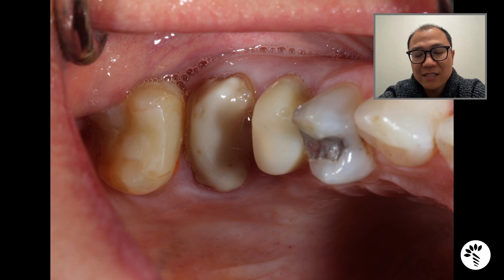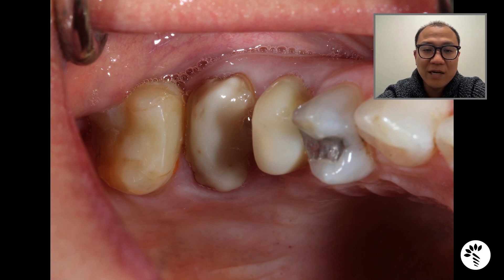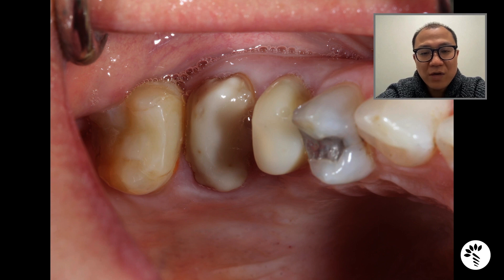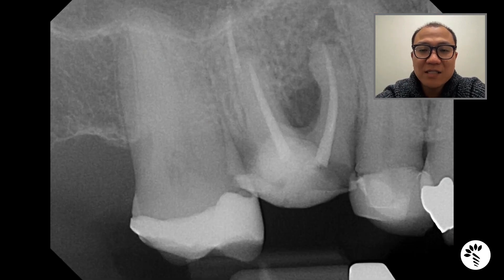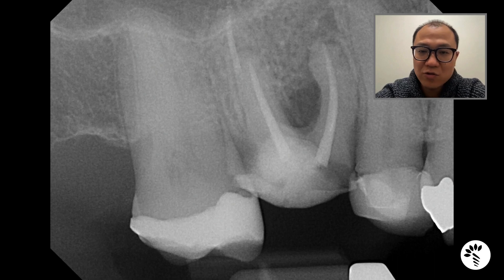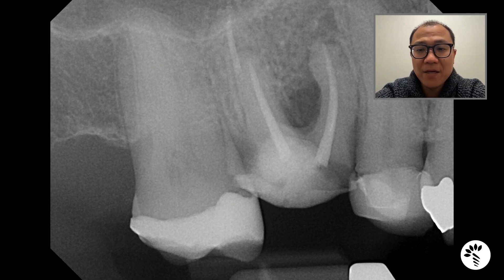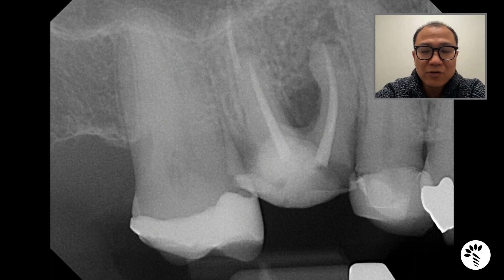Lisa had a temporary restoration on tooth number four, which is the second premolar, which will later be crowned in the future. When you look at the radiograph of tooth number three, you can clearly see that there is possibly a periapical lesion on the mesial buccal root. It has existing endodontic treatment, bone loss around the furcation area, and you can clearly see there was some caries around the tooth.